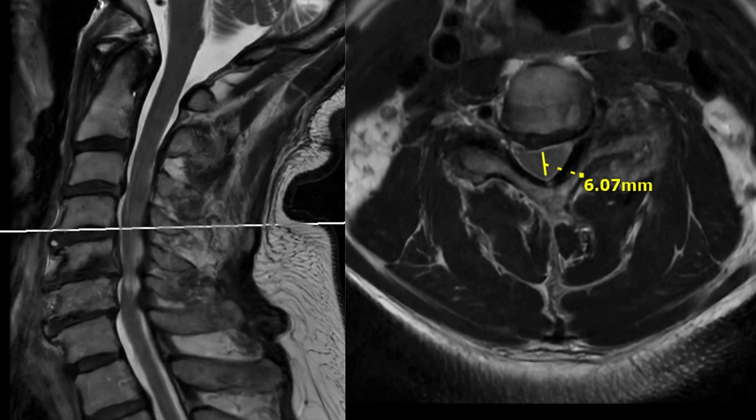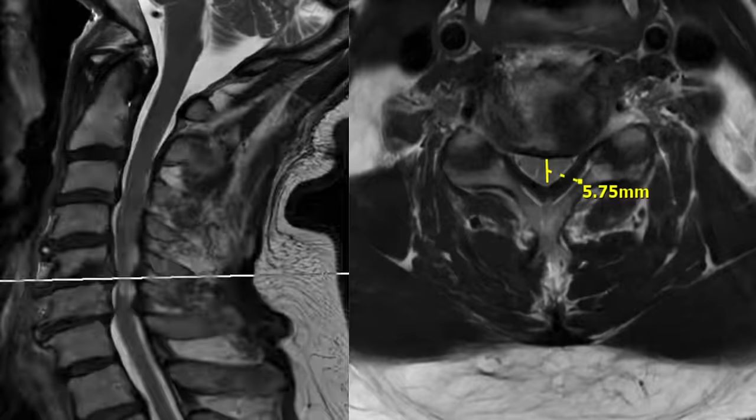This is his MRI image. This is the base of the brain here, and this is the spinal cord coming down — C2, C3, C4, C5. Looking at C4-C5, he has severe central stenosis right in the middle and also what's called foraminal stenosis. So the nerves as they're leaving the spinal cord at every level are getting pinched. The next level down is C5-C6.